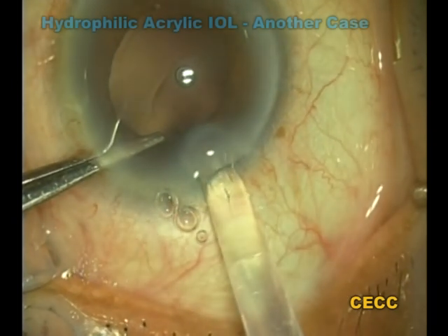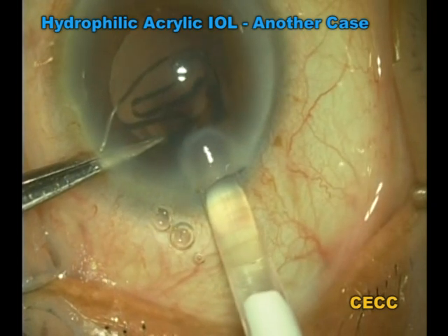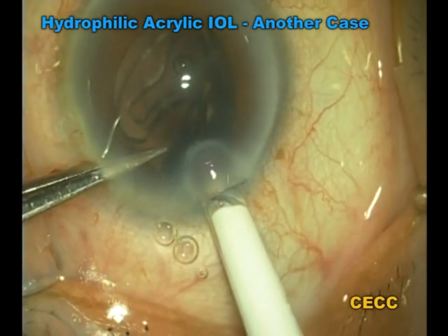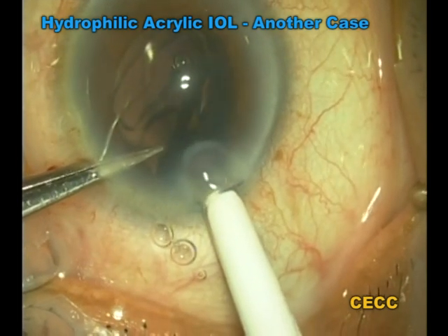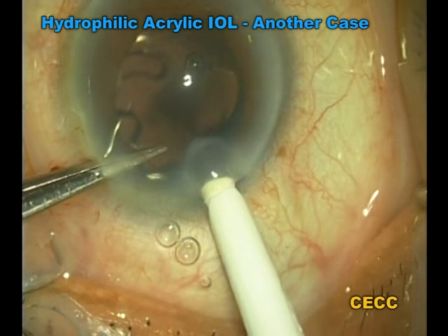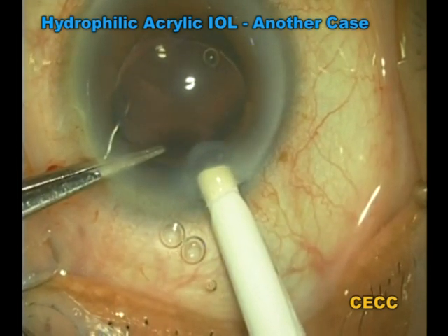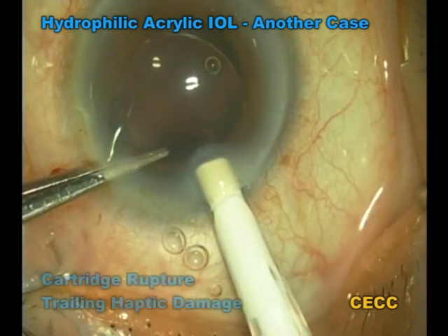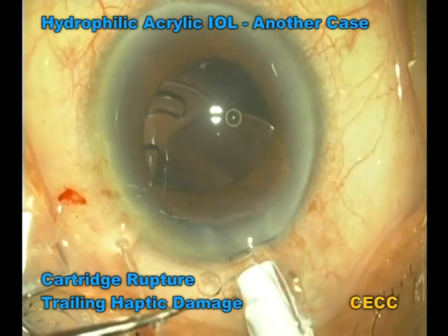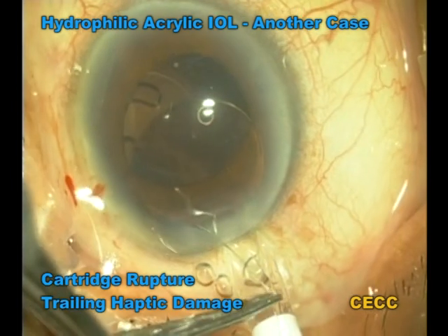This is another case that deals with difficulty in the release of the trailing haptic of a hydrophilic acrylic IOL from the cartridge. The early stages of IOL implantation proceed smoothly. The trailing haptic would not emerge from the cartridge tip since it was incarcerated between the plunger tip and the cartridge wall. On further pressure on the plunger, the cartridge tip ruptured, revealing the laceration of the trailing haptic. This IOL was exchanged.